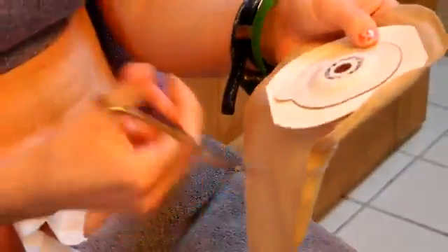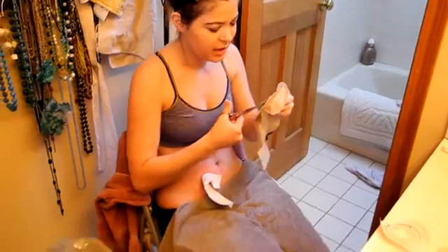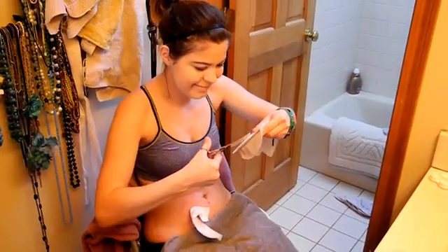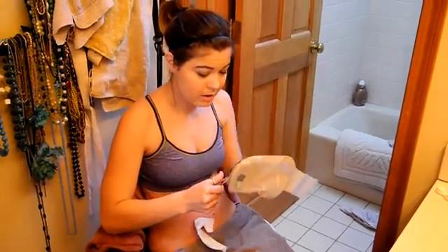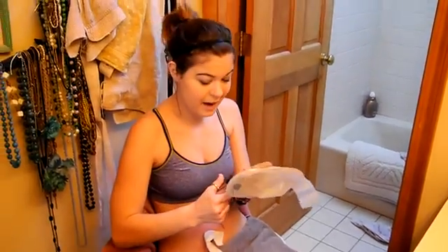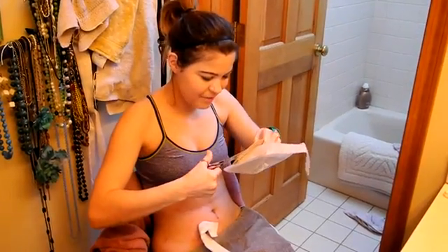Okay, and now we cut. Okay, so I use these rounded, curved scissors. Thank you. And that just helps cut a round circle. You want to make sure that you pull the bag away also so that you don't cut the plastic in the bag. Then you'd have to start all over again, and that could get frustrating.